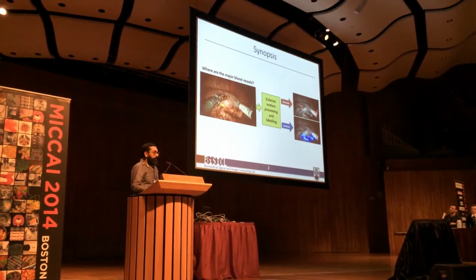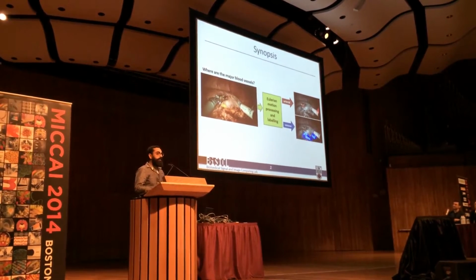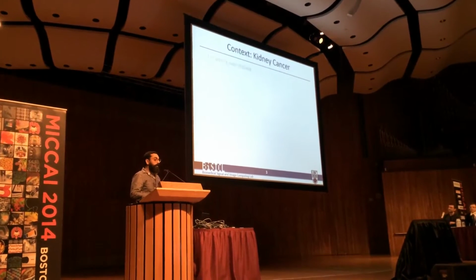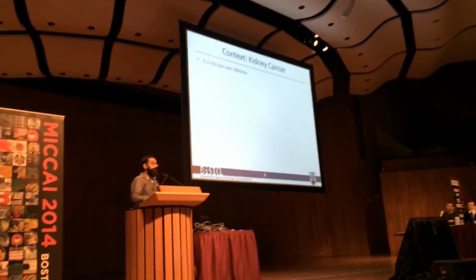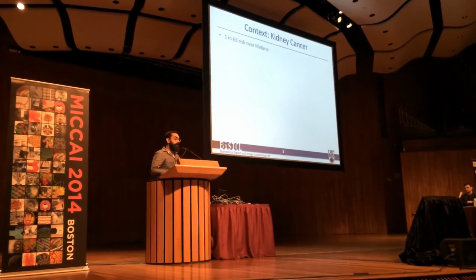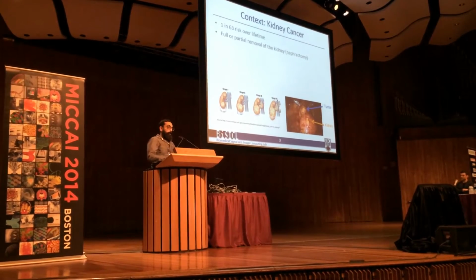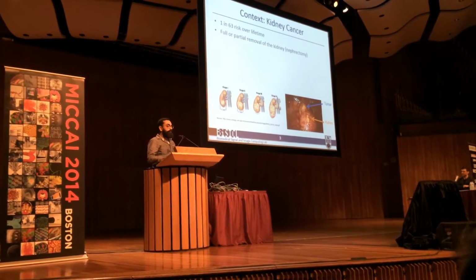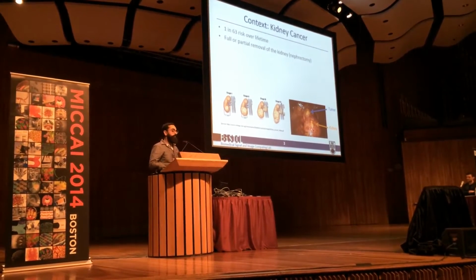But before delving into how we accomplish this, I would first like to motivate this application in the context of kidney cancer surgery. Kidney cancer is common. It is ranked among the top 10 most common cancers in both men and women, with each American having a 1 in 63 risk of developing it in their lifetime. Full or partial removal of the kidney, also known as nephrectomy, remains the most common and successful solution for this particular type of cancer, specifically renal cell carcinoma.